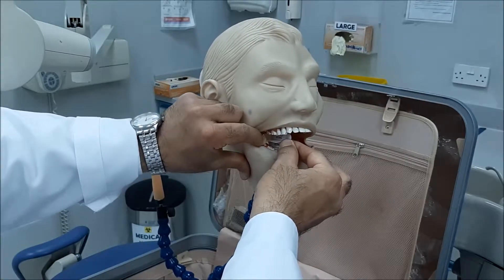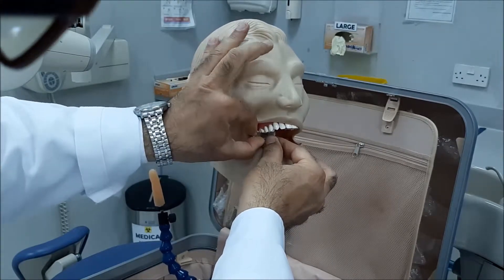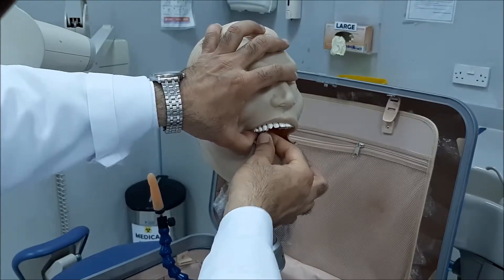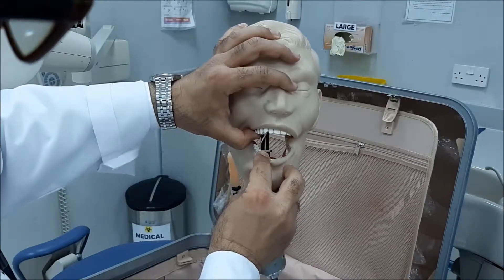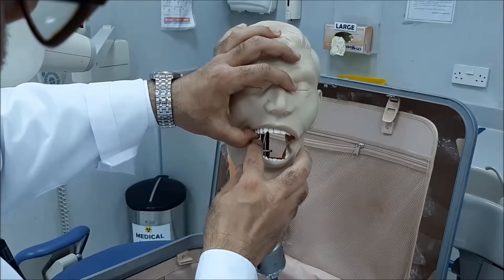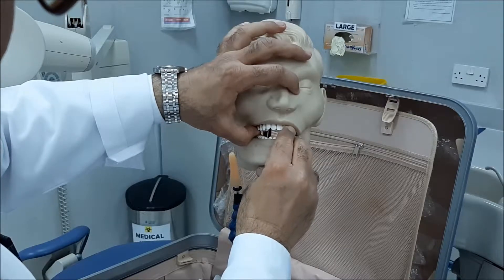You place the tab over here, all the way, as much as you can, backwards toward the midline, and then you support it. The next step is to ask your patient to bite. Try to push it so that the film will go in a lingual direction.